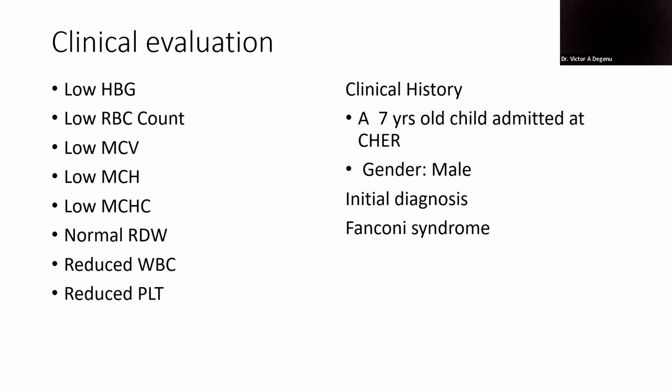So clinical history: a 7-year-old child admitted at child health emergency, gender male, initial diagnosis Fanconi syndrome. So what do we know about Fanconi syndrome?